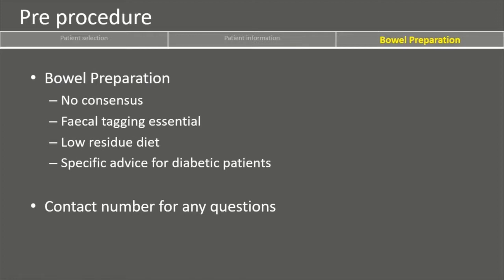There's no consensus with regards to bowel preparation, but it's vital. Fecal tagging is essential. We use Gastrografin, but as I say, there's no consensus. Other places use Picolax and Omnipaque, but either way, you need to have clear documentation and guidance for the patients.